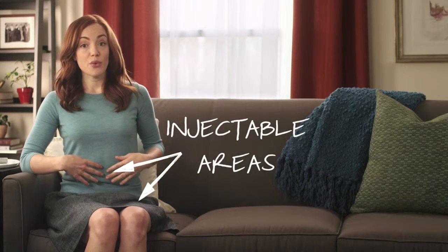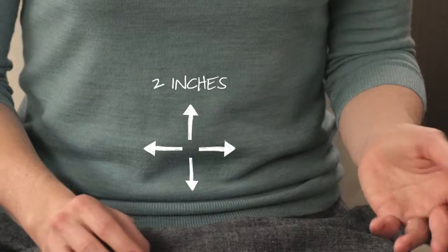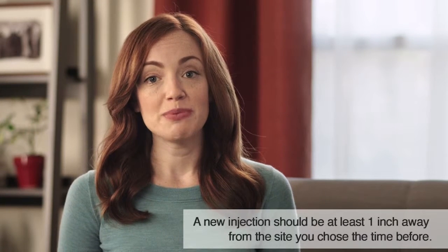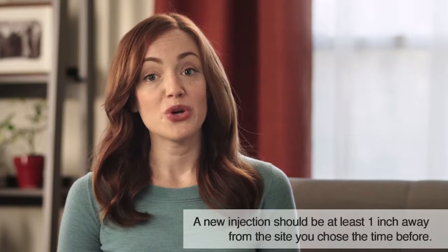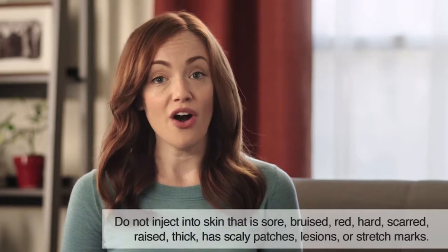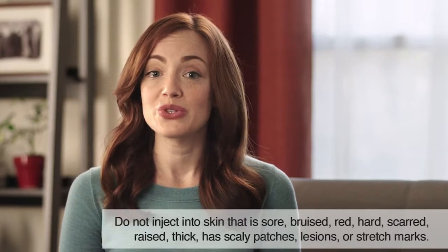Right now, I'm going to inject myself on the front of my thigh. The other site you can use is the lower stomach area. If you choose the lower stomach, make sure it's at least 2 inches away from the belly button. Each new injection should be at least 1 inch away from the site you chose the time before. And my doctor said not to inject into skin that is sore, bruised, red, hard, scarred, raised, thick, has scaly patches, lesions, or stretch marks. And to be sure not to inject through clothing.